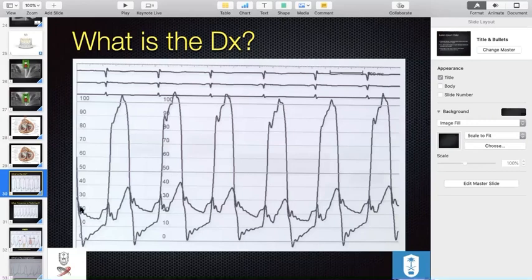So let's start with one of them. I'll just start with the small one, okay? Let's start with this. I usually love the diastole, what's happening there. So you can see here what's happening in diastole. It's really not going down as we expected, but you can say it's a bit horizontal. Maybe a bit of a downslope, but let's assume it is a downslope here and horizontal over here.